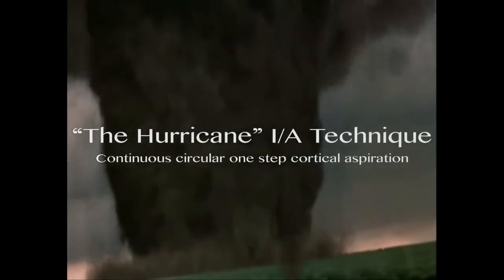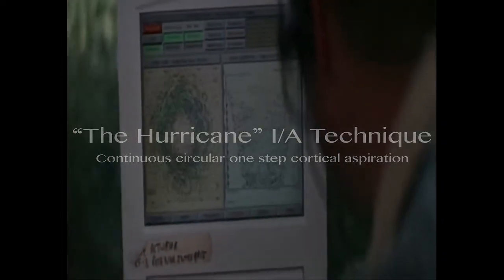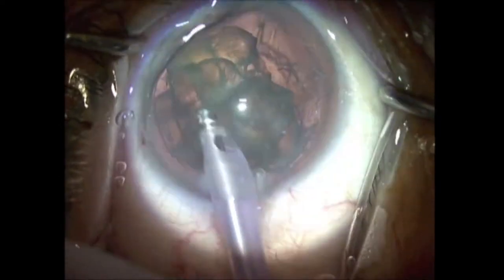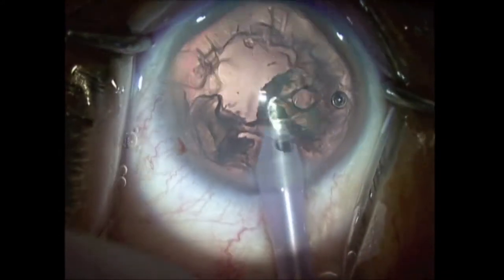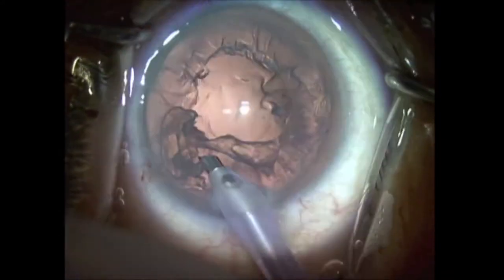The Hurricane Cortical Aspiration Technique. Phacoemulsification is the gold standard technique used during modern cataract surgery for the last decade. Lately, use of femtosecond laser provided an even better predictability and safety in several steps of these surgeries.